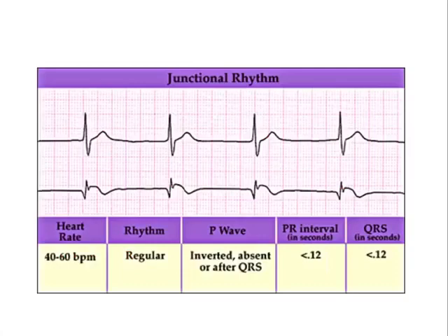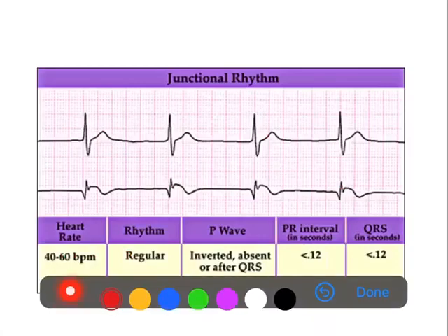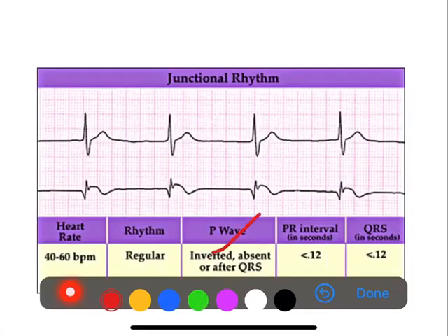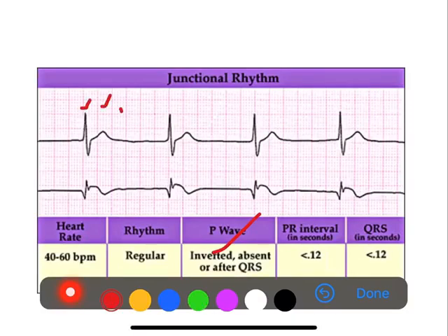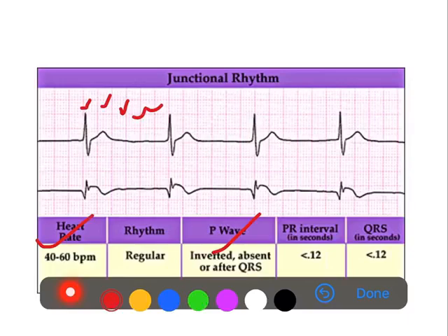This is an example ECG. You can see that there is no P wave, which meets the first criteria of absent P wave. Calculating the heart rate by counting large boxes — 1, 2, 3, 4, 5, 6 — the heart rate lies between 40 to 60 per minute. Regarding the PR interval, since there is no P wave, we cannot calculate it directly, but we consider a PR interval of less than 120 milliseconds. The QRS is also less than 120 milliseconds. These criteria confirm that this ECG represents a junctional escape rhythm.